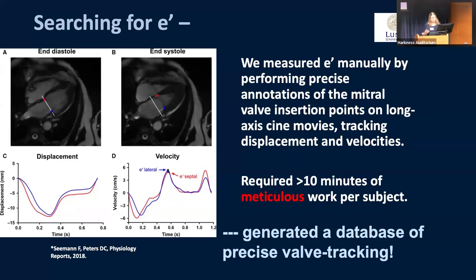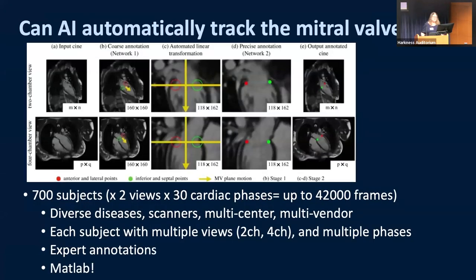So in doing this work, we really generated this huge database of precise valve tracking. So of course, it was 2019, so we said, can we use deep learning to automatically track the mitral valve? And here you can see our framework. We had 700 subjects. We had a multi-vendor, multi-scanner technique. We had expert annotations, and we actually did this in MATLAB.